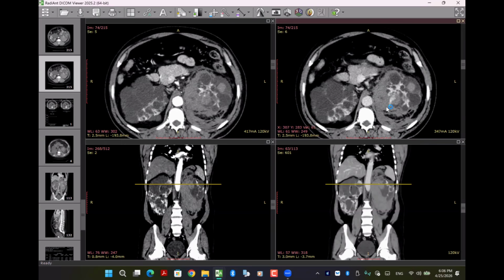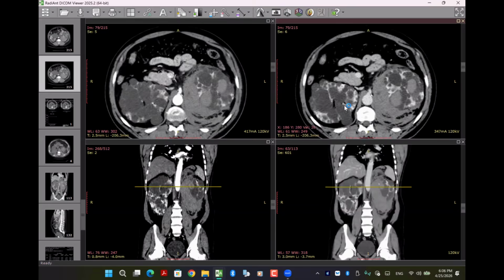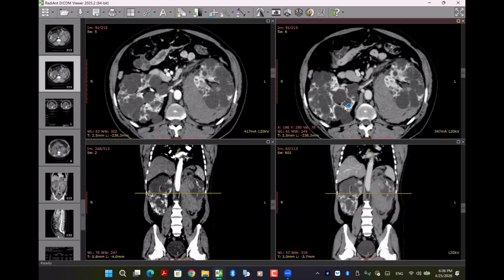They are associated with hepatic fibrosis, so we'll advise a hepatic study after it. And LFTs, intrarenal. What else can we miss inside this one? Any polycystic, any enhancing mass? Exactly. Yes. We should look carefully after we stabilize the case. We should take a second look for any hidden RCC inside this patient.